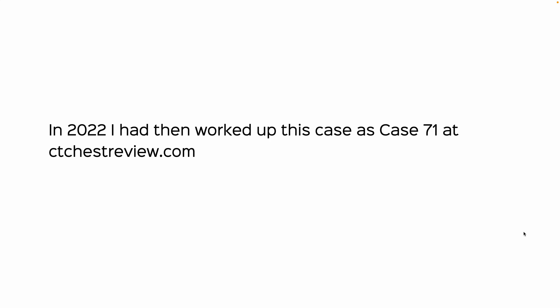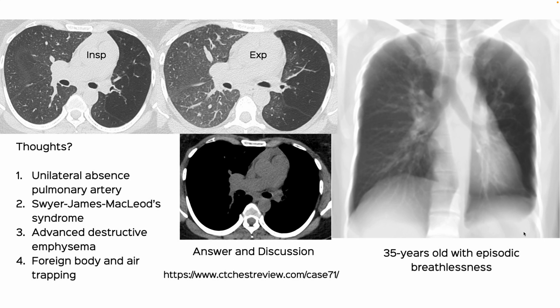I had worked this up as Case 71 at CTchestreview.com, and this is how I presented it. Shown here is the mean reconstruction — that's the small left pulmonary artery. The question was: is this UAPA, Swyer-James MacLeod syndrome, emphysema, or foreign body and air trapping? This is just classic Swyer-James MacLeod syndrome.